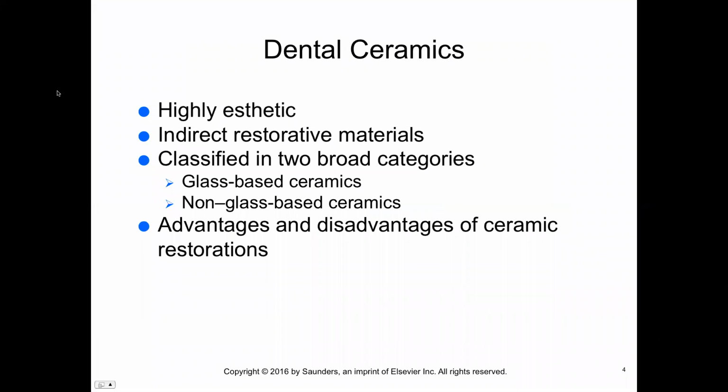So what are dental ceramics? Ceramic materials are highly aesthetic materials, but they're also prone to fracture because they're brittle and weak when used in the high-functioning areas of the mouth. Dental ceramic restorations can be created only in a laboratory. Over the past 3 decades, these materials have increased in strength and have been used widely.